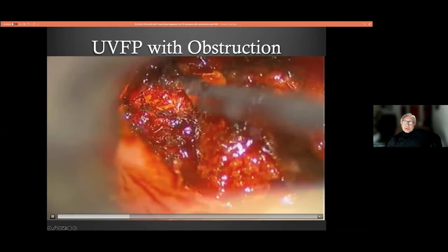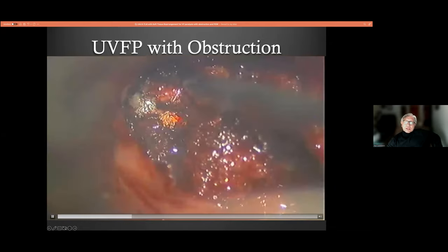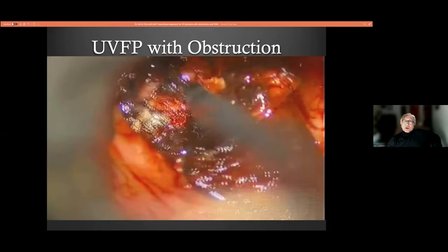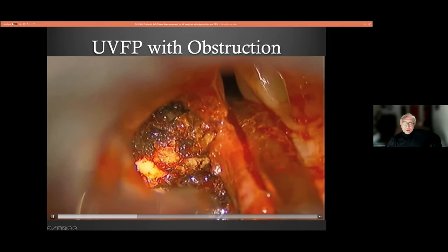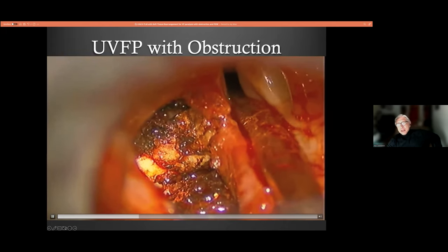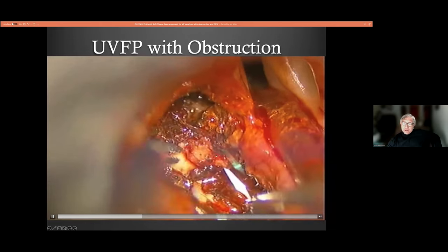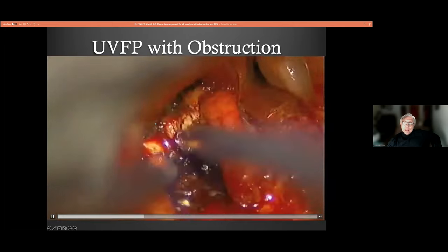Now, once I realized, okay, yes, I have a flap of tissue that I can produce, I'm now getting down more distally. So this becomes the augmentation lateralization laryngoplasty. That tissue is implanted in the paraglottic space and bulks and medializes the anterior, and the lateralization stitch that is placed also within the wound through the thyroid lamina soft tissue.